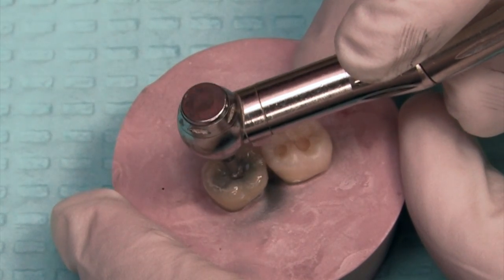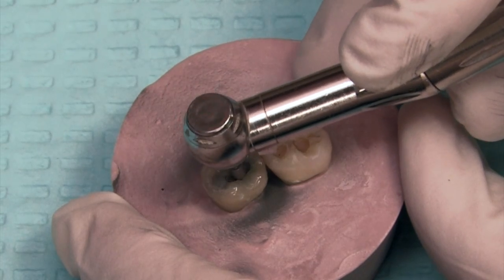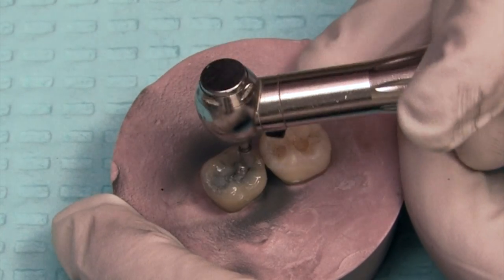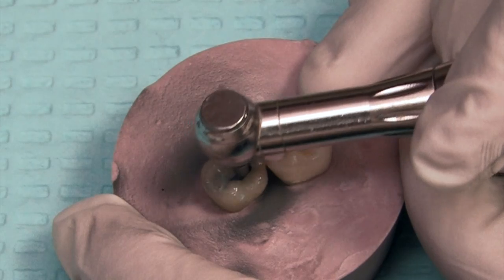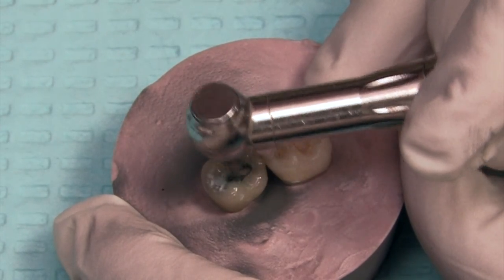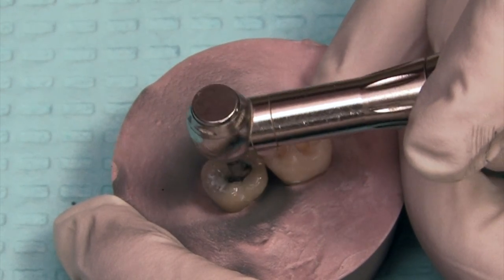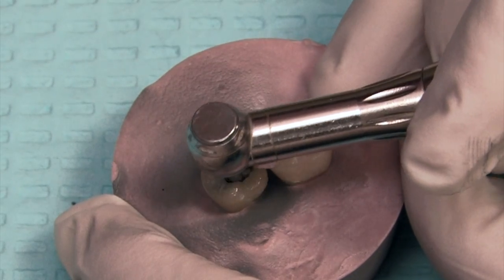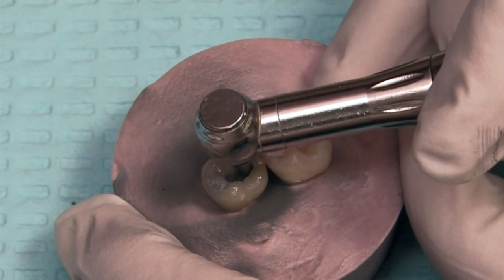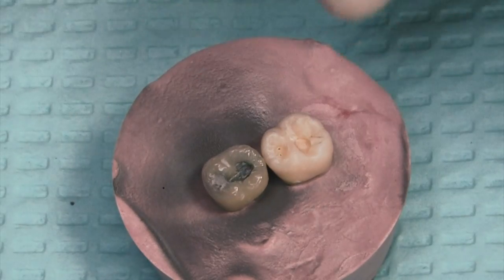I'm going to assume that this tooth has interproximal decay, and we're going to remove the silver filling first. I like to get that part out of the way, and then we can move on to work on the interproximal. Again, if I was using water, this would be a much cleaner prep. Just going back and forth removing the decay — I tend not to stay in one spot terribly long, just because I don't want to heat up the tooth in that area.